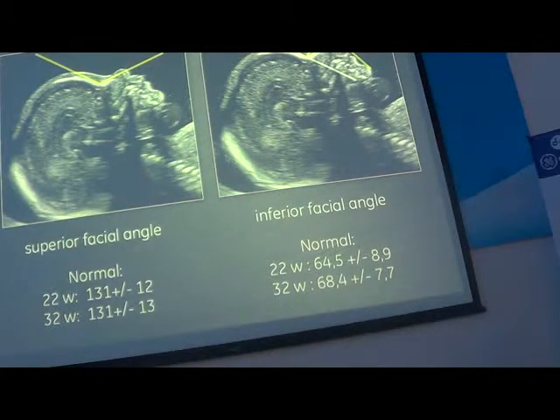On the face, we can do measurements. We can do the measurement of different angles, but you will not use it for the screening examination. It's only when you suspect something, across the regions of the face that we have to scan.